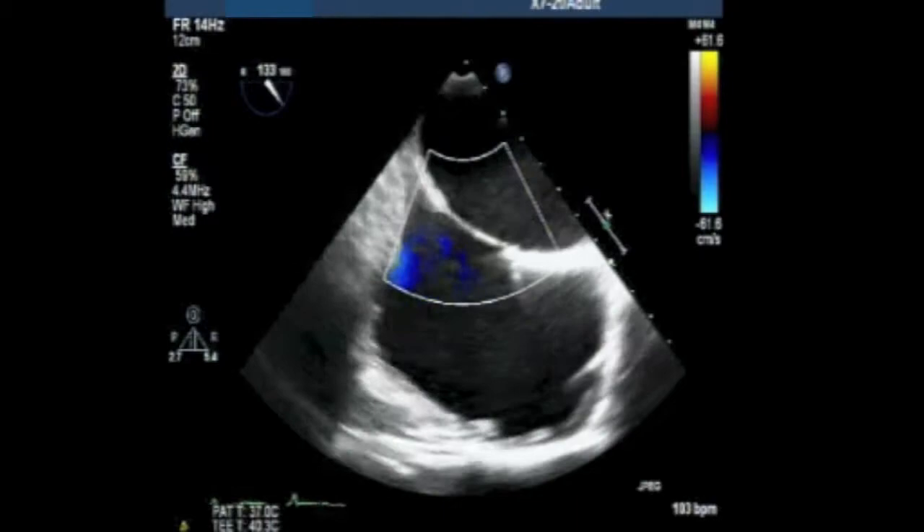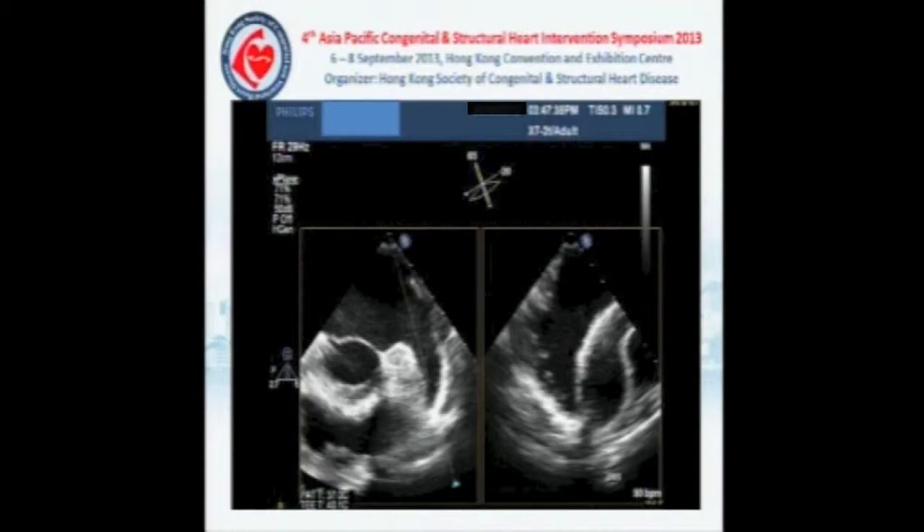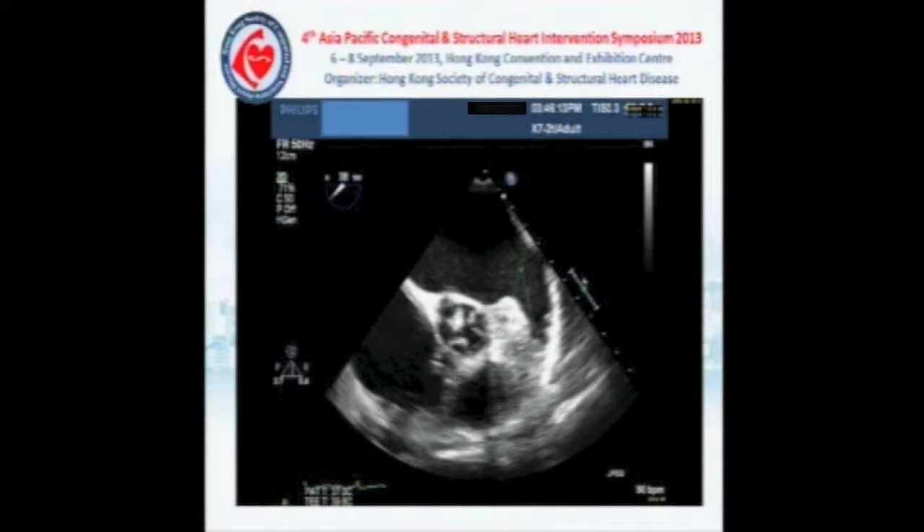This is the bicaval view — there is no PFO or ASD. The LAA is clear of thrombus. The biplane view confirms there is no thrombus inside the LAA.